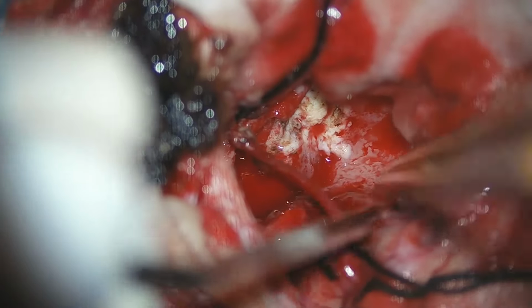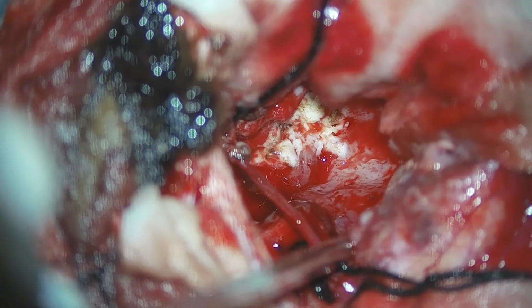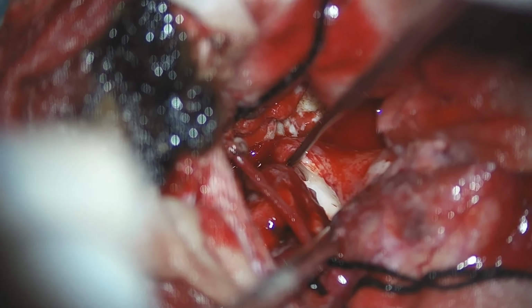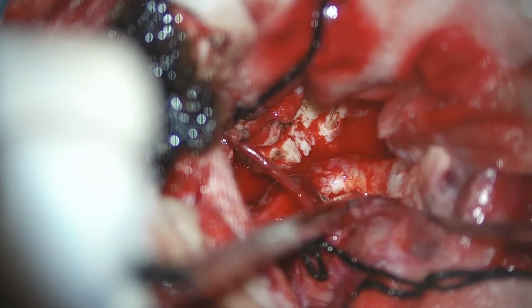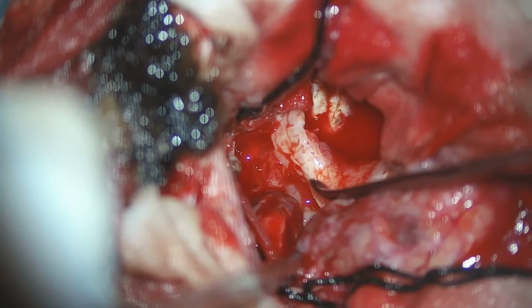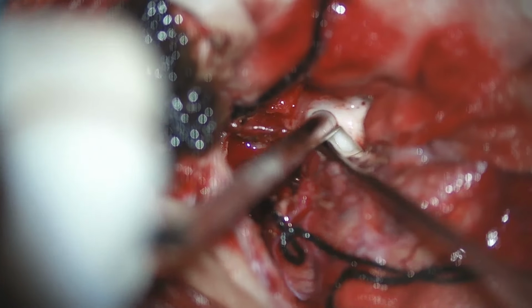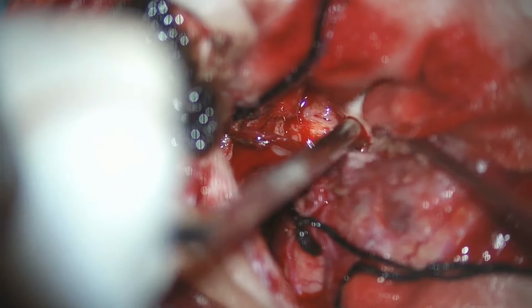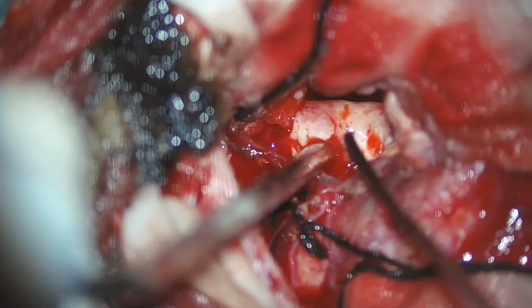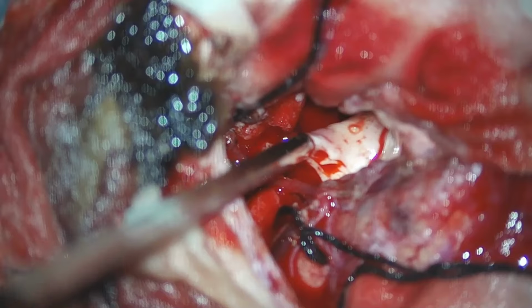See, now after removing the tumor bed, we can see the normal brain that is popping out from the undersurface of the tumor. The plane is being created between the tumor bed and the normal brain. You can see the color difference between the normal brain and the tumor. We try to achieve a good margin of resection in these cases, as it is in the frontal area.